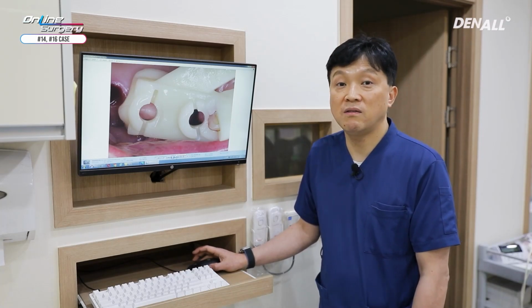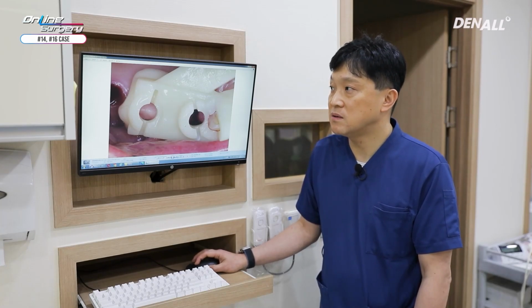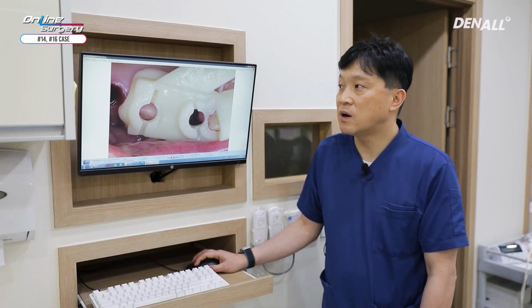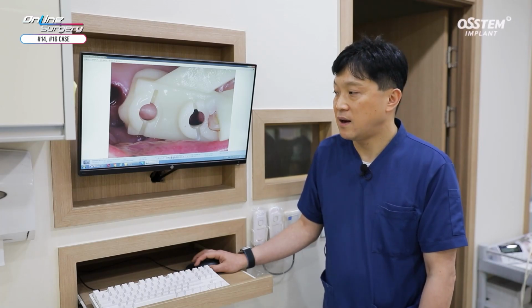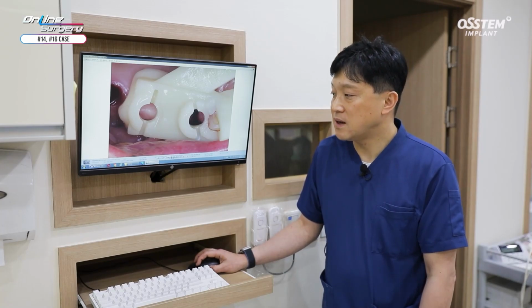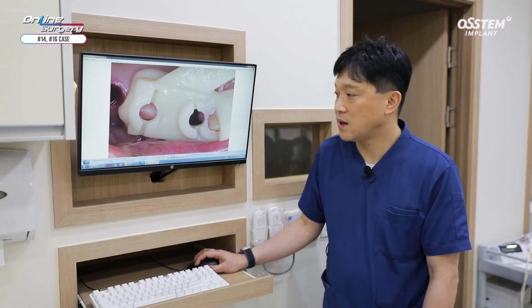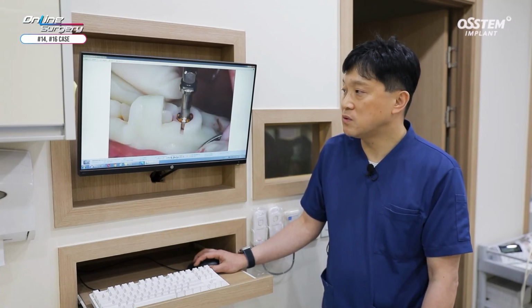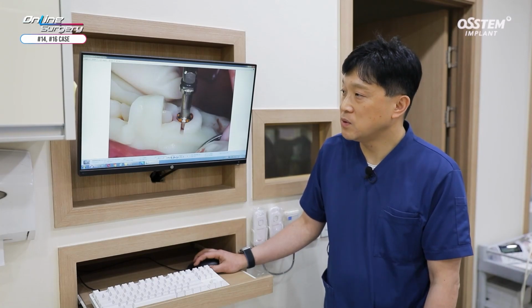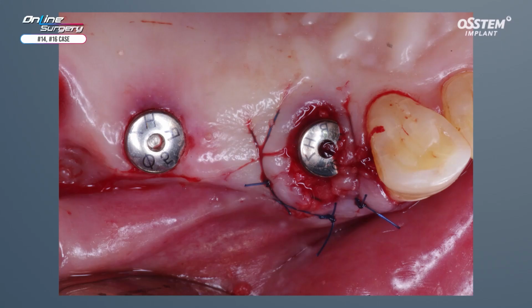We use one guide for accurate surgery. The 3D printer that is used frequently is insufficient in securing the desired accuracy. I would like to recommend you to use the template that has been printed out from the OSSTEM center. You can see that surgery has been done nicely despite of it, and the process of adapting the template was very difficult. Surgery was completed as shown.